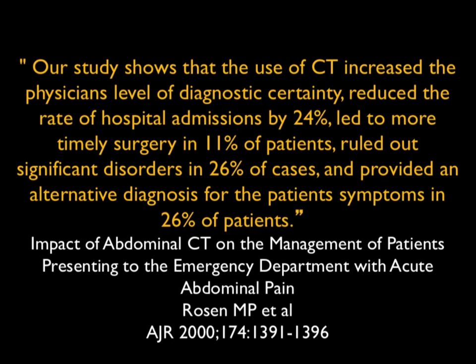Going backwards, you find the correct diagnosis, and maybe it's a suspected diagnosis. You find the unsuspected diagnosis because CT is not organ specific but can see everything. And at the end of the day, it changes your management, whether it's 24% the rate of hospital admissions or more timely surgery or less timely surgery in 11% of cases.